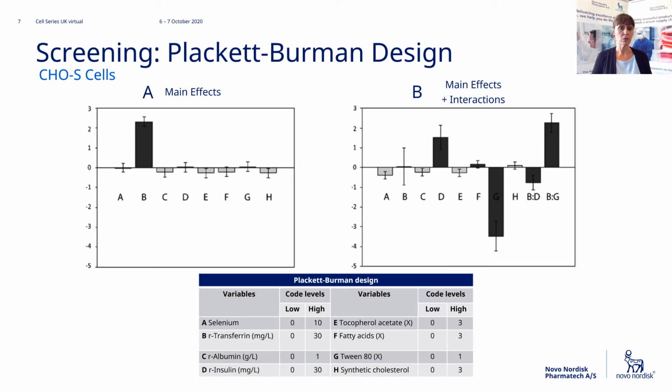The first part of the work consisted of a folded over PBD, so Plackett-Burman design, and was used to detect possible synergies between different compounds in the screening phase. PBDs are developed to eliminate factors having no or negligible effects over the responses. This means that only main effects are considered without detection of factor interactions leading to potential incorrect decisions.